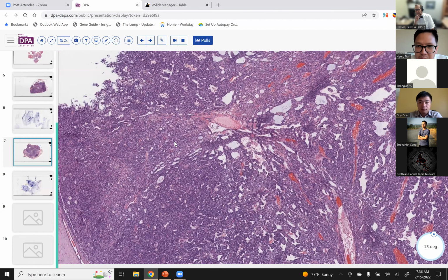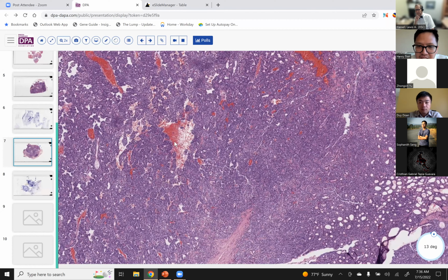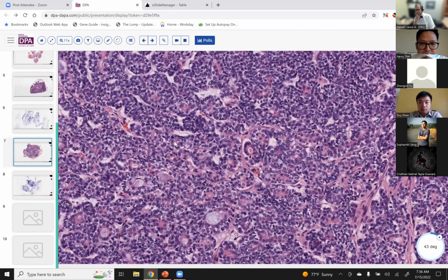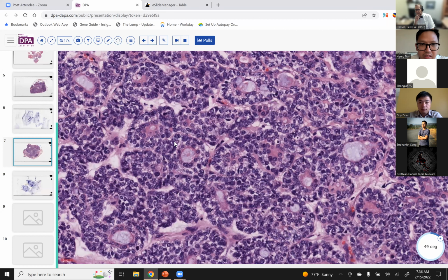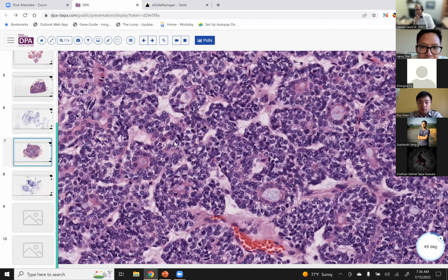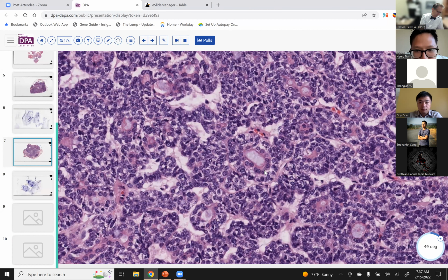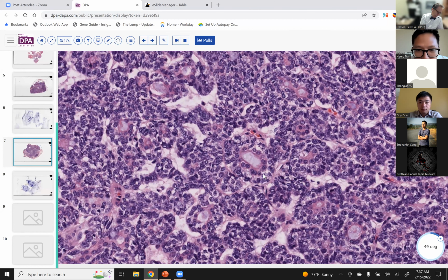And then some more cystic areas here. So check out these cystic areas on higher power. Solid. So here's a good example in the middle here. So what we're kind of seeing is a biphasic looking neoplasm.